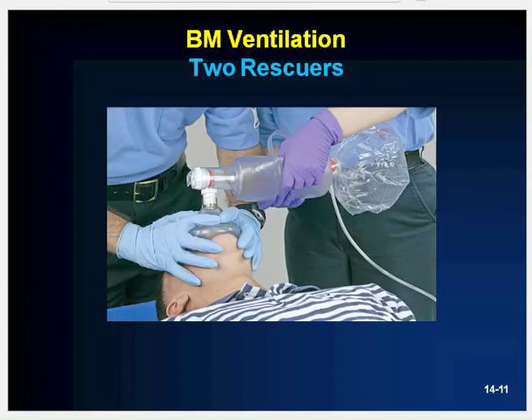Two-rescuer ventilations are comparable, with the only difference being that one rescuer is solely responsible for maintaining the mask seal and the airway, while the other rescuer is tasked with delivering ventilations using the bag.